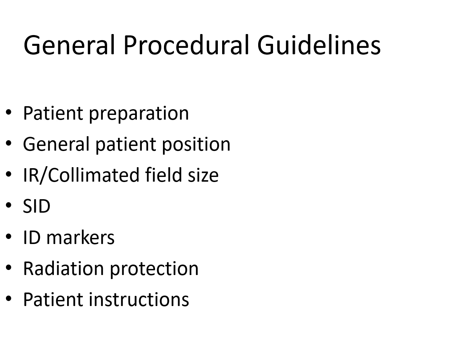If the bra strap is in the way, perhaps they can take the bra strap down onto the shoulder or off of the shoulder to get a metal-free image. For the open mouth projection that I'm going to show you, we need to remove the dentures if those are removable. Any tongue rings should also be removed if the patient cooperates with that instruction.